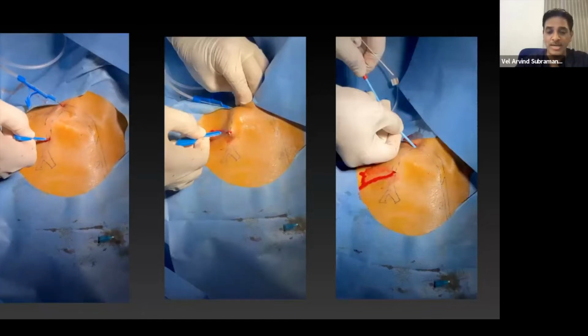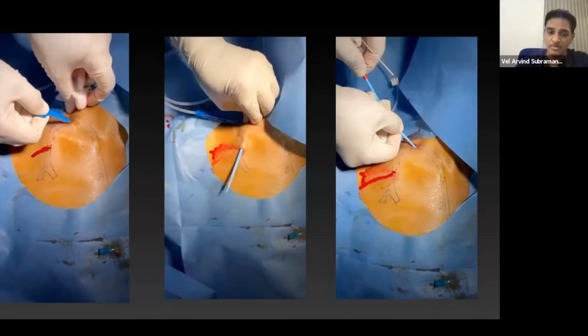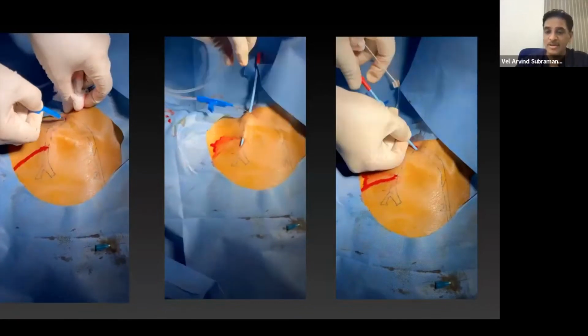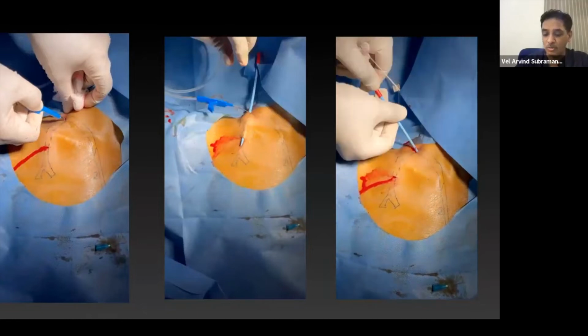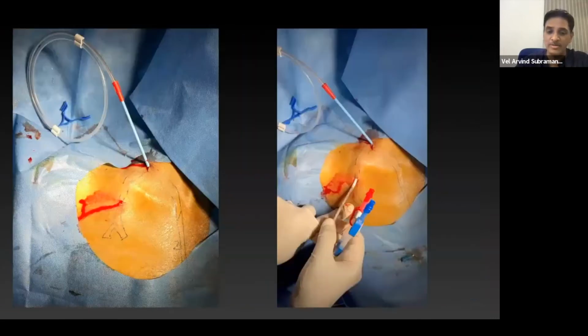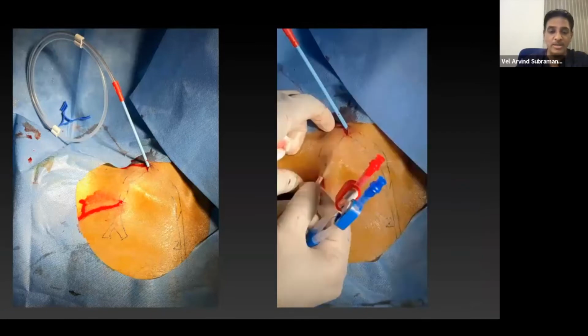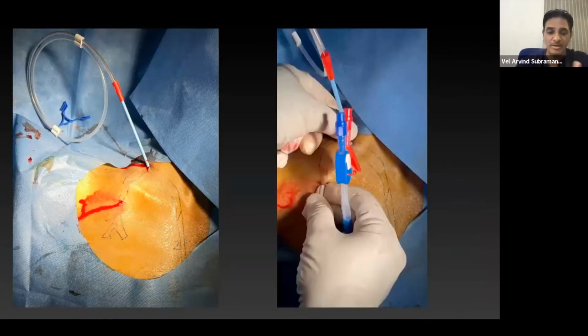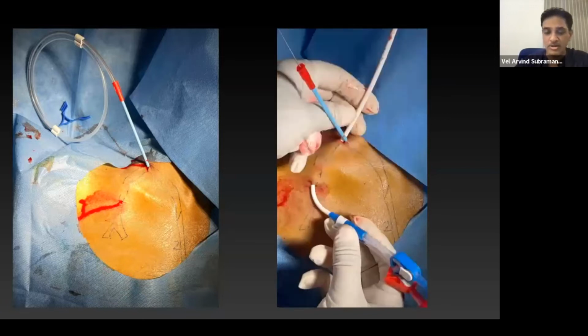I use the dilator provided in the kit for making a tunnel, or I use an artery mosquito or straight artery forceps. Then I dilate the vein over the guide wire. Then I keep the dilator in situ because I'm working single-handedly, so I avoid any bleeding from that dilated vein. Then I push the pre-cuffed catheter through the tunnel, or you can use the artery forceps. You can pull it, or you make the tunnel a little patulous and can pull it just like that. You can push it; it will come out on the other end.